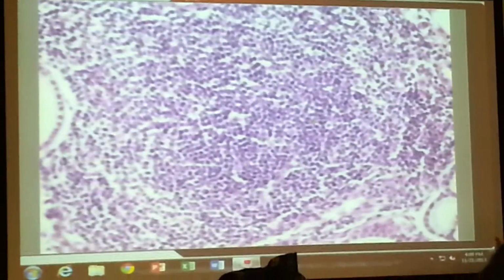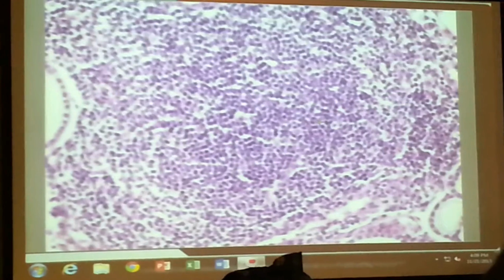But again, parathyroid just on its own is really hard to distinguish, but because you'll always see it next door to thyroid, it's not that bad. Adrenal gland is identified mostly by the layers.